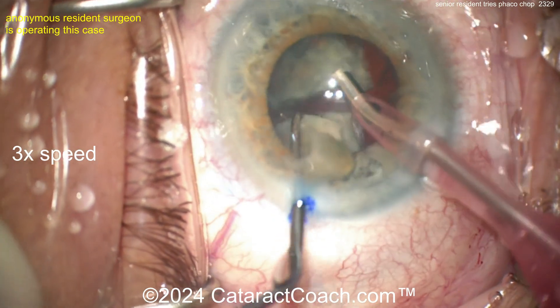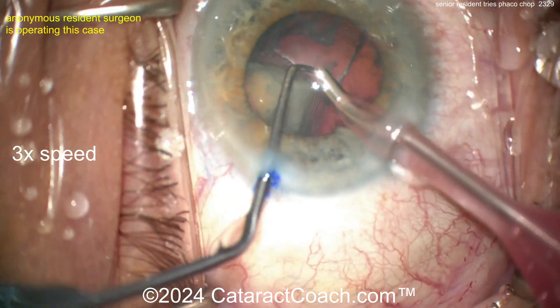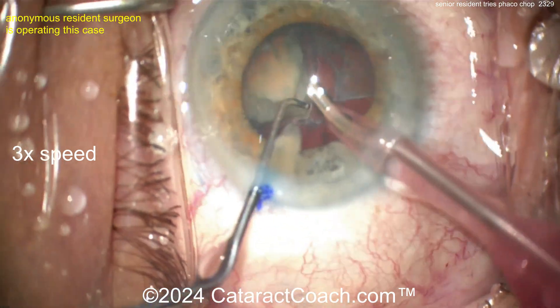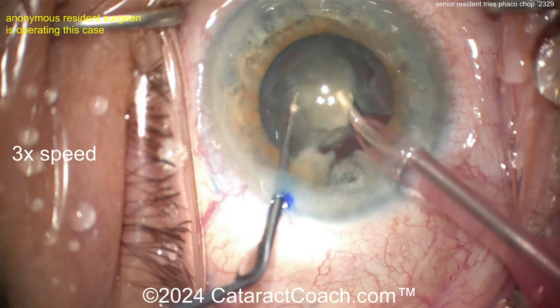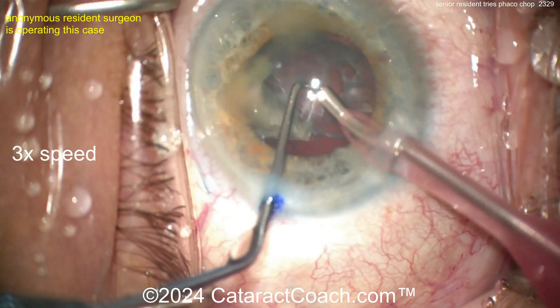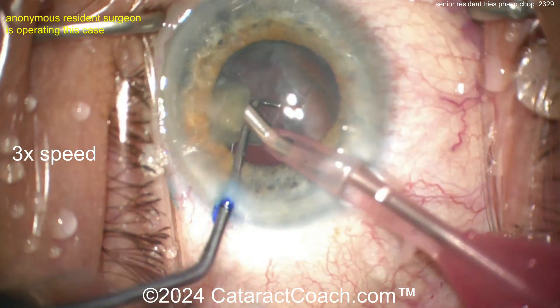Beautiful combo chop — beautiful case! This makes me so proud to see a resident doing surgery of this caliber. I think every senior resident should aspire to be this good at the time of graduation. A really nice chop technique, beautifully done.